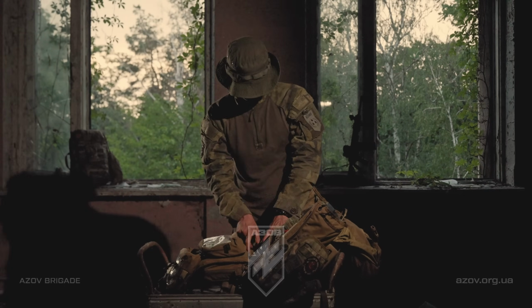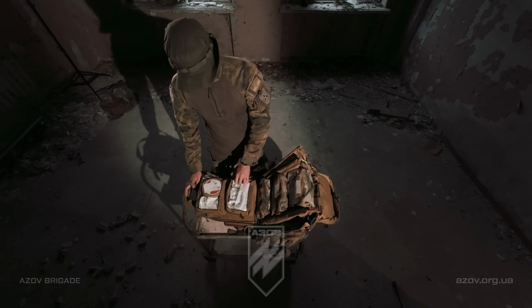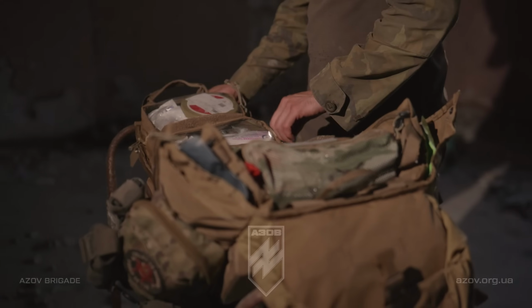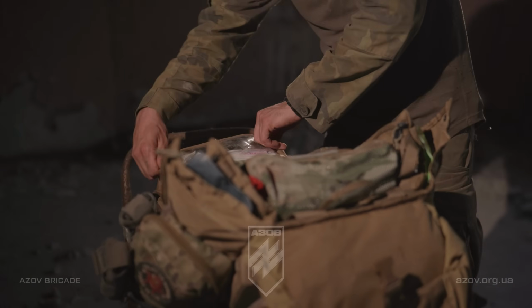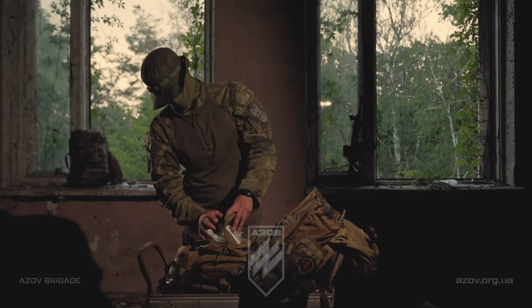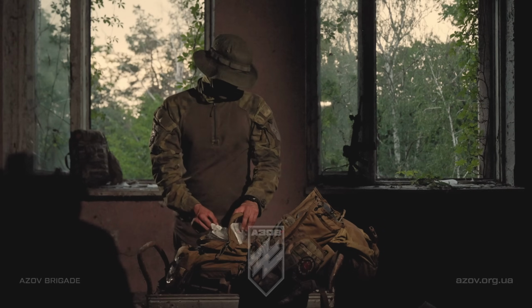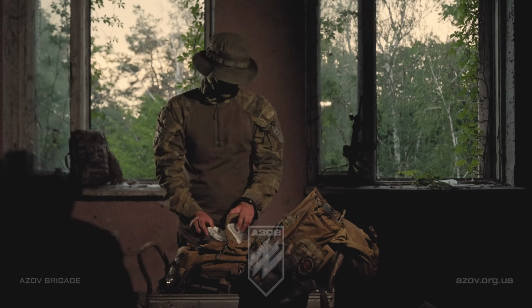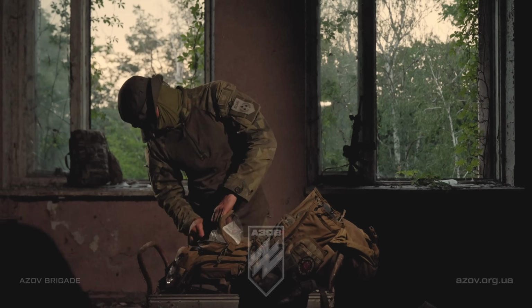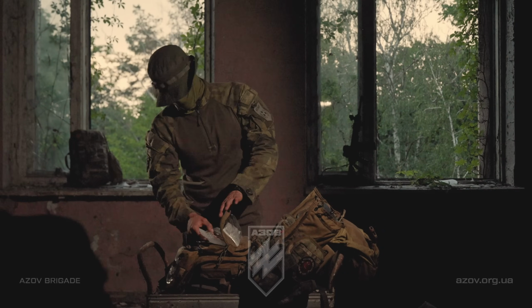So in this pouch here, it's just spare catheters, IV lines, syringes for drawing my medications out. I can show you what I've got in here. So I have 5ml syringes, a couple of 10ml syringes, a couple of 20ml syringes. I've got catheters that range from 18 gauge up to 22 gauge. And I also carry about 5-6 salines, 20ml salines.